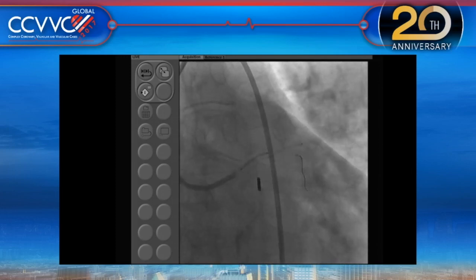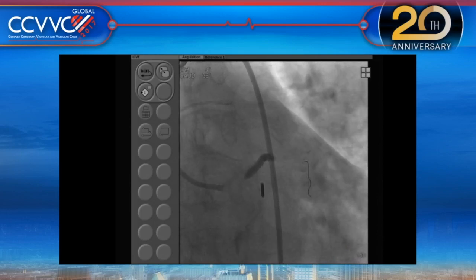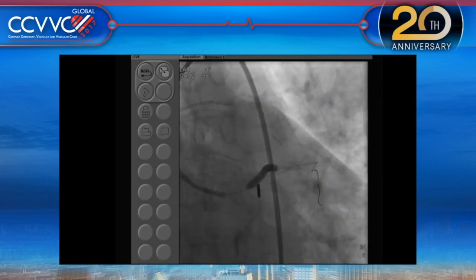It's become a habit. And we have not corroborated or confirmed or disproved that hypothesis by doing the IVUS after single inflation versus two inflations. Yeah. I think that will be a small good project for the fellows.